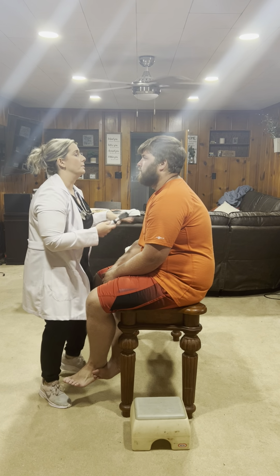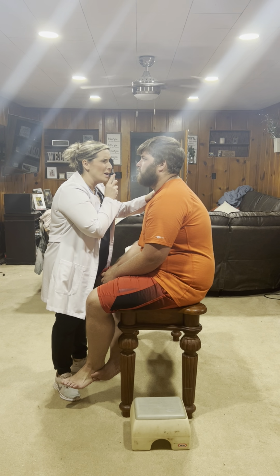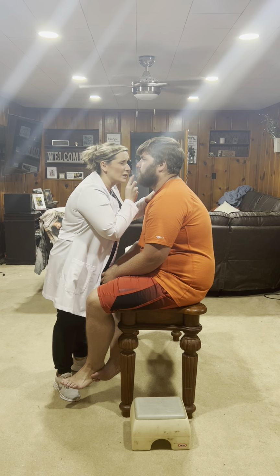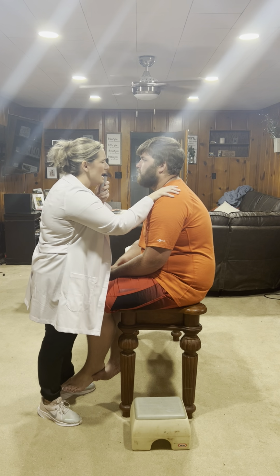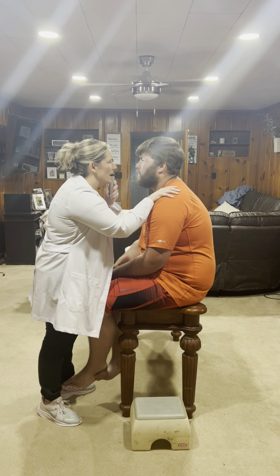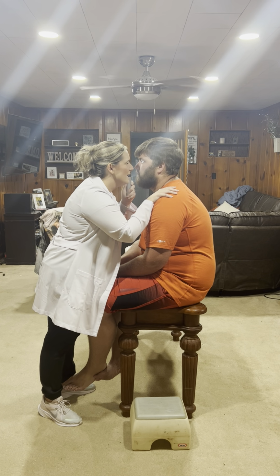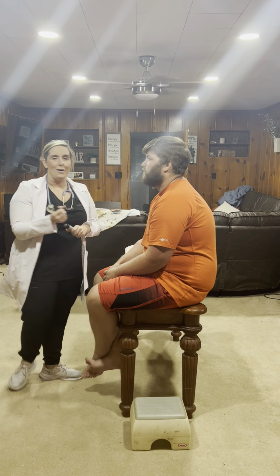All right, I'm going to put my hand on his shoulder. We're going to look for the red light reflex. Once we find it, we will move in, looking for any nicks. And I'm going to do the same in this eye. I'm going to find the red light reflex. There we go, and move in, looking for any nicks in the internal eye structures. All right.